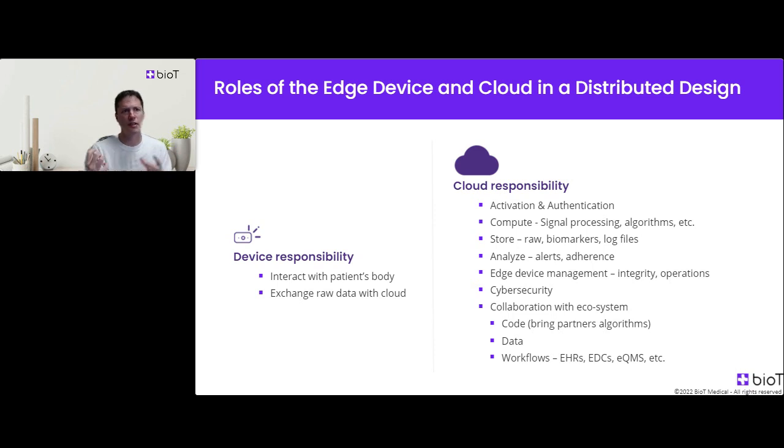Now, when the device is sending raw data, usually there is very little to do with waveforms or all those raw data bits. So cybersecurity now is mainly on the cloud, which is a huge benefit because it's more control. It's in a controlled environment, and every time someone tries to hack, you can detect that hack, unlike if they just take a device to the lab and disassemble it without you as a manufacturer knowing about that.